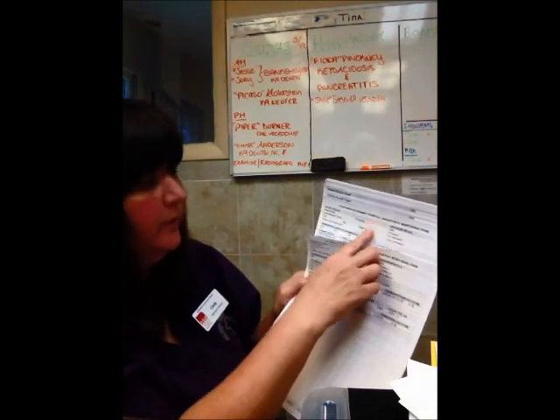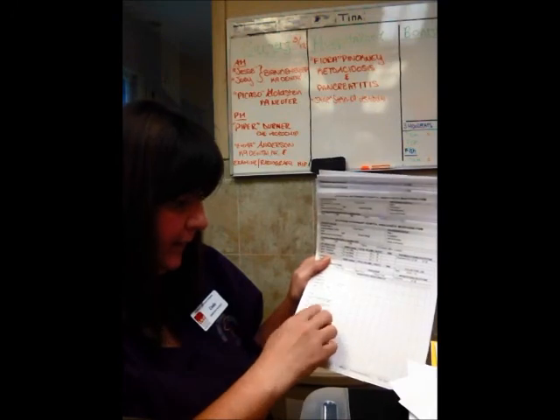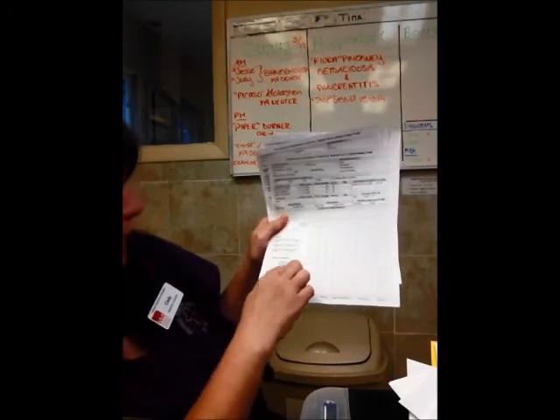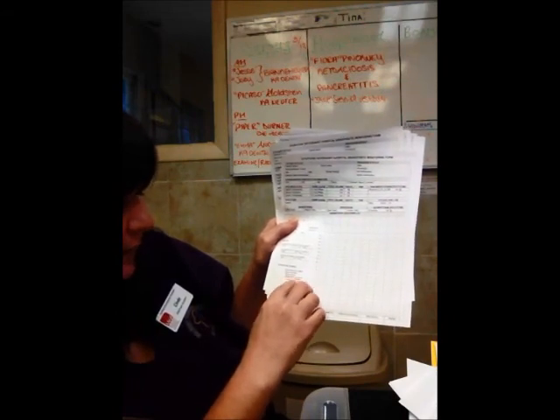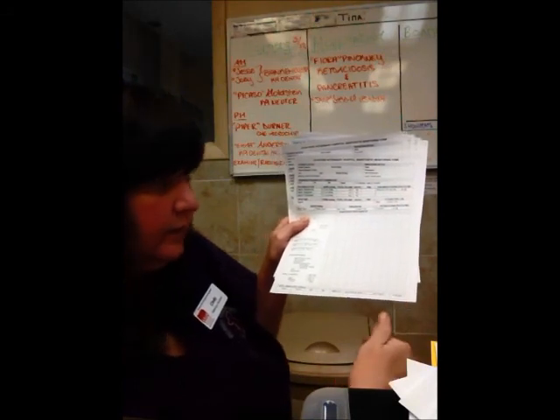As soon as we have the patient's weight, we'll do the math and figure out what they would be getting, and if they get it, what time they have gotten it. So to monitor, we monitor their blood pressure, their pulse oximetry, their capnography, and an active warming device, depending on whether they're in the OR or they're out of the OR getting a dental in the treatment room.